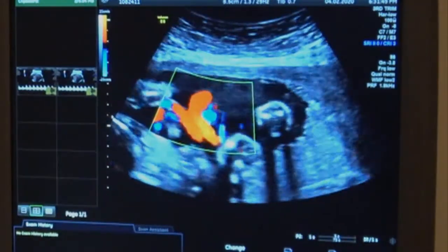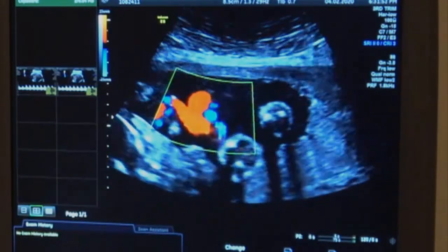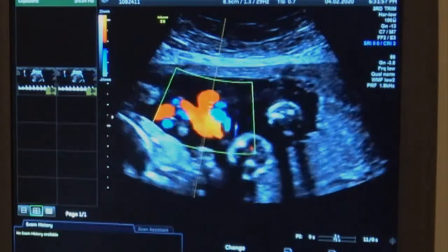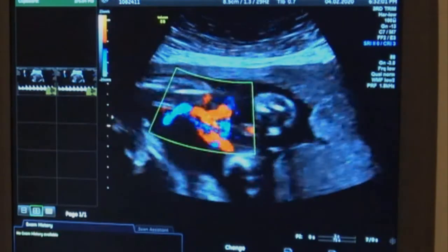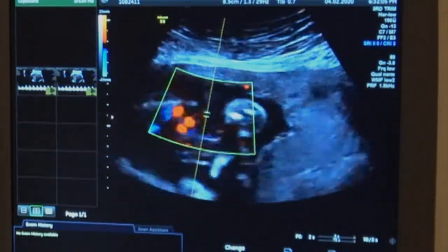It is good, again, to try and use a bit of the artery that's at 0 degrees. So I'll just pop it on. That's not going to work. What's that? That was a pain. Hang on a minute. Find the artery.